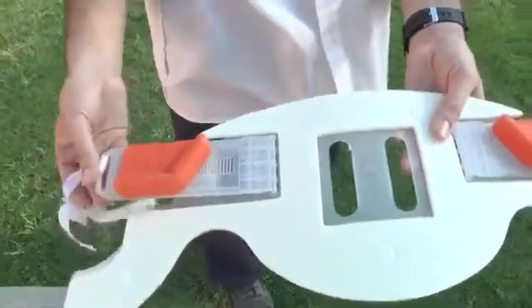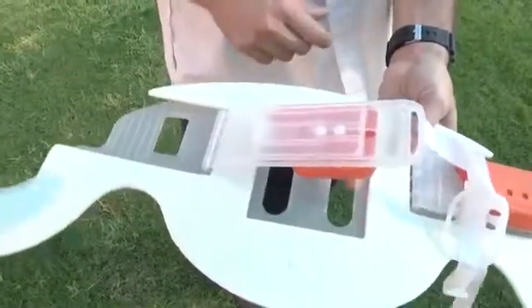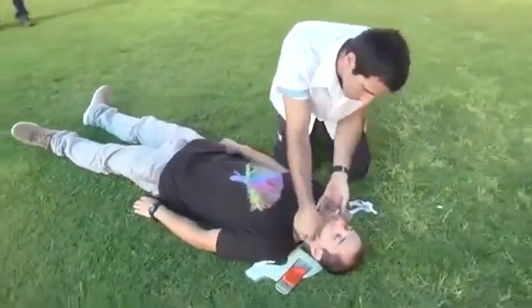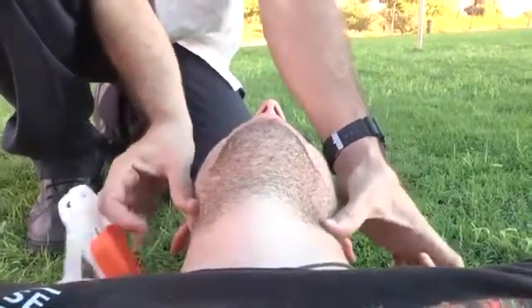There is no need for pre-placing measurements or adjustments off the patient's neck or other pre-adjustments, as in other cervical collars. Slide the Lubbo under the patient's neck gently. Do not move the patient's head.